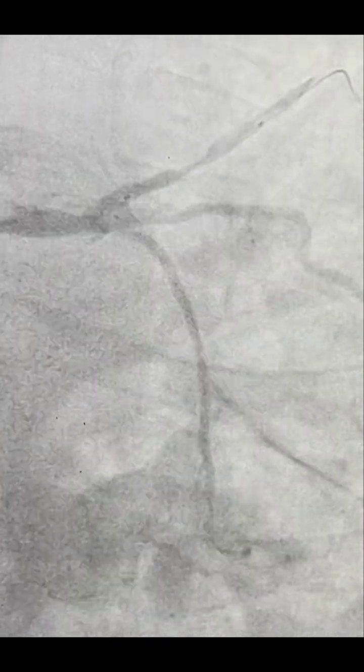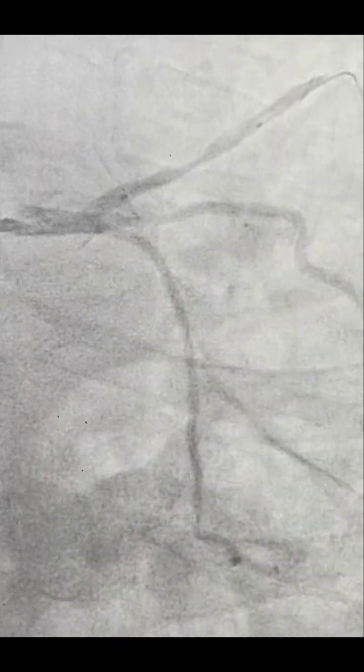So straight away I proceeded with this stent. This is a 3.5 by 24 stent, and this is the positioning of the stent. Then the stent was deployed at around 12 atmospheric pressure, 16 was RBP. This was a 3.5 stent, and this was the scene after the stent. It went well. There was no slow flow, although we anticipated slow flow.